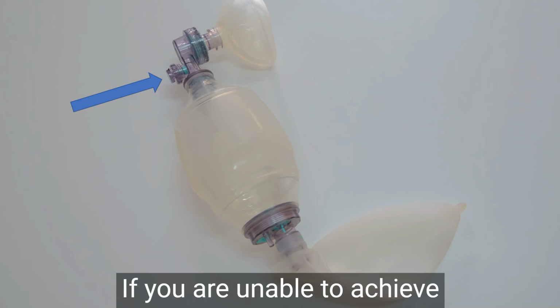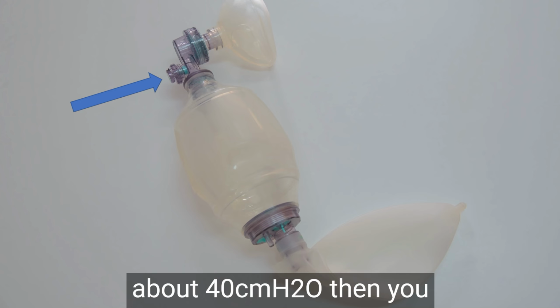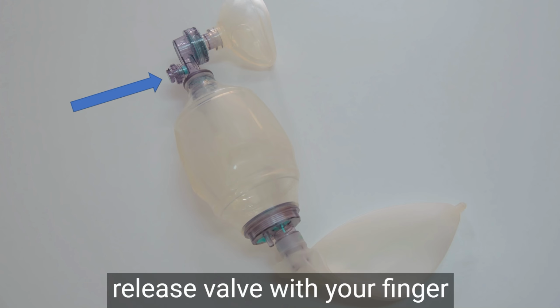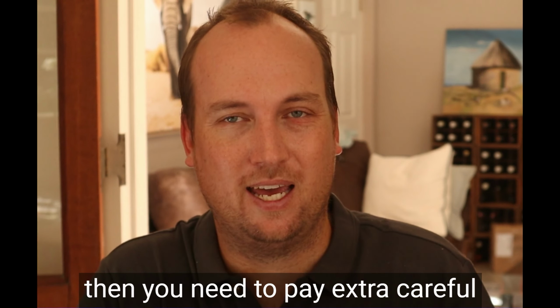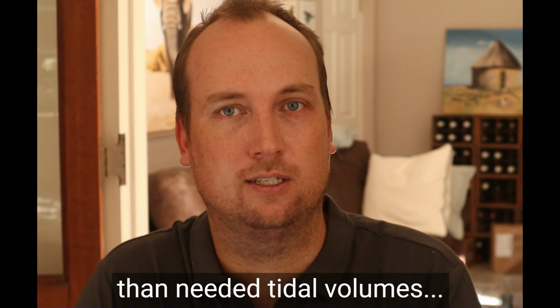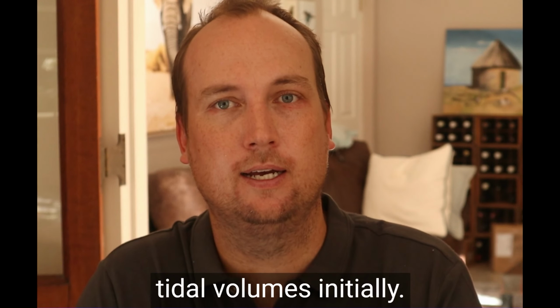If you are unable to achieve any air entry without going above 40 centimeters of water, then you can hold in that pressure release valve with your finger while squeezing the ambubag, but then you need to pay extra careful attention to not delivering higher than needed tidal volumes. So just aim for 200 ml tidal volumes initially.